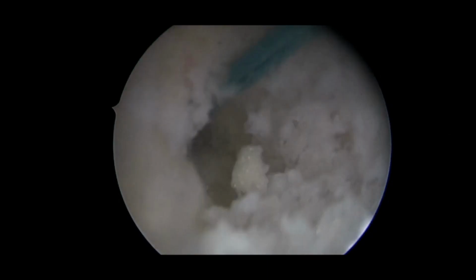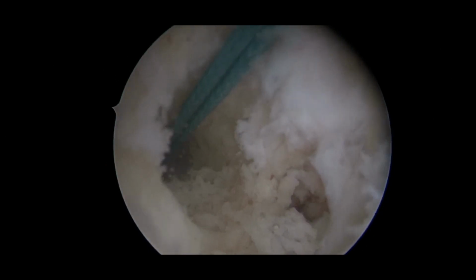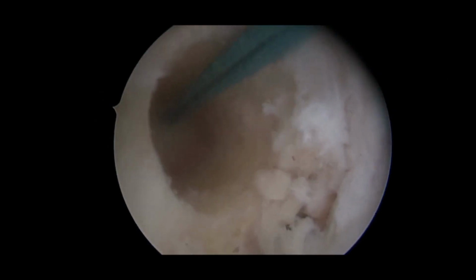The suture is being shuttled through the femoral tunnel with the help of the guide wire. All the debris generated during the drilling of the femoral tunnel is being removed with the help of a shaver. As you can see, there is good bone stock all around the femoral tunnel.